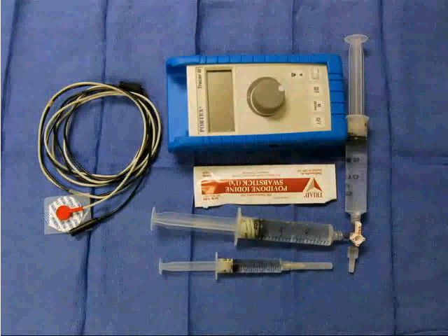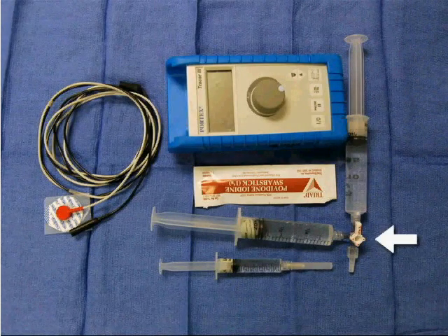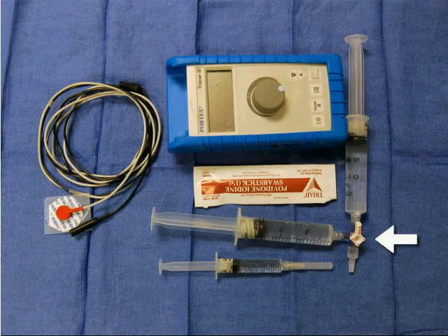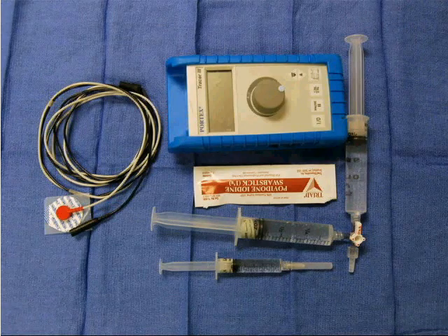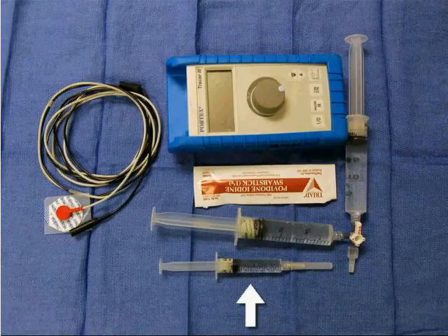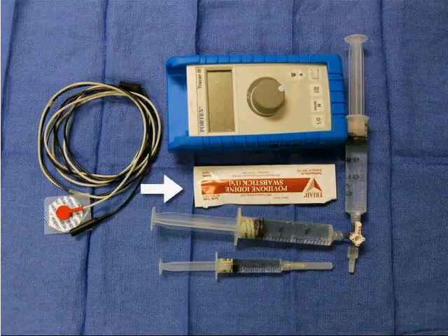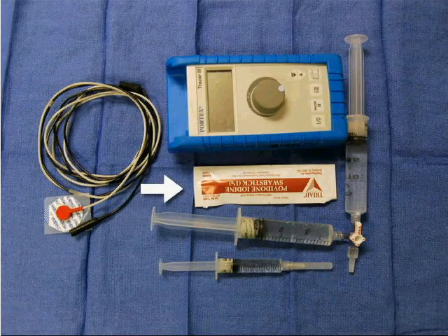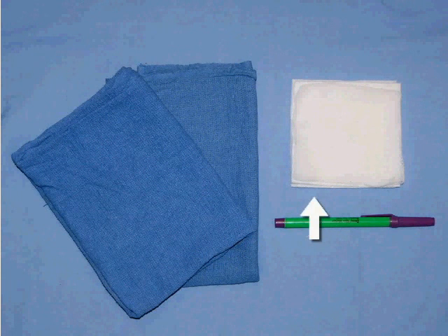The equipment required to perform a popliteal nerve block includes a nerve stimulator and electrode, two 20-milliliter syringes connected by a stopcock, and 40 milliliters of the anesthetic of your choice. You will also need a 5-milliliter or tuberculin syringe with 25-gauge needle, 1% lidocaine, and povidone-iodine swabs. Obtain a 22-gauge 50-millimeter insulated stimulating needle, a marking pen, sterile towels, and sterile gauze.